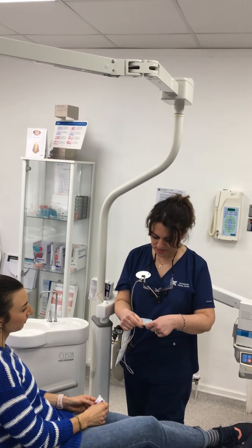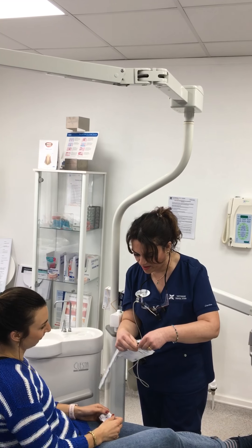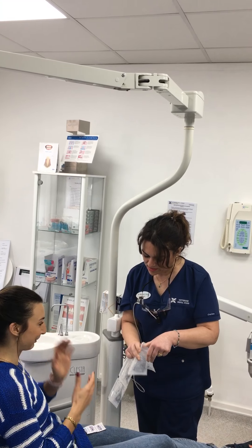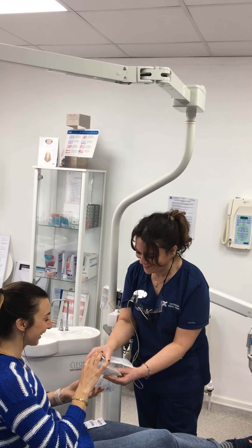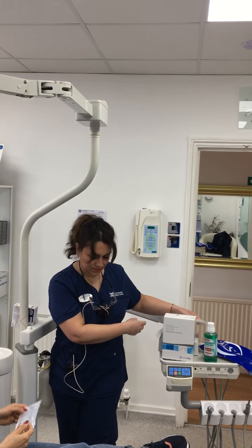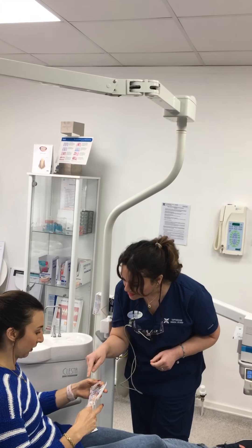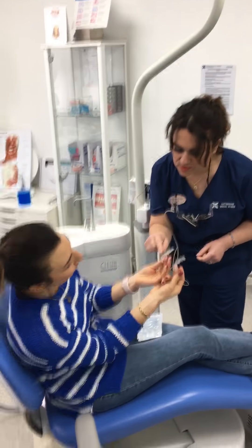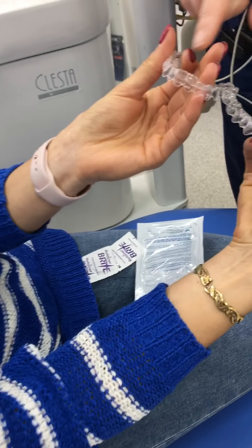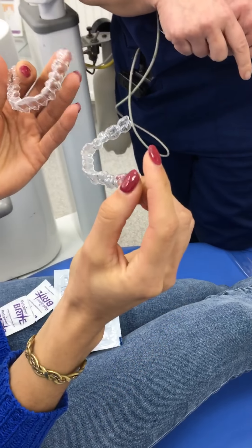So this is your number one aligner. Very easy — just tear it from here, and then you can spread it open. So if you want to zoom in on them: that one is the top one, they have the bigger teeth. You can pop the top one in.